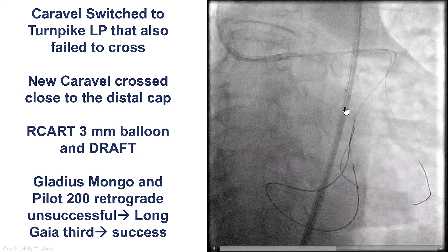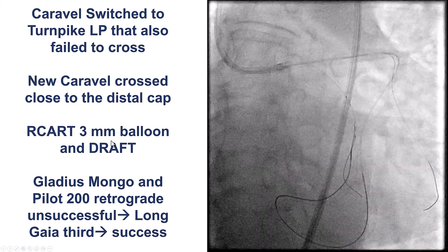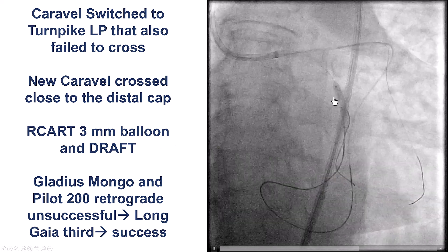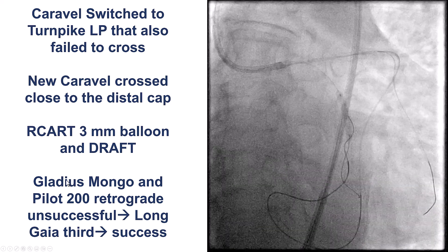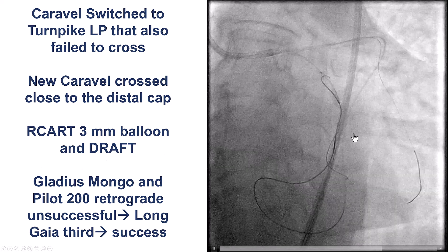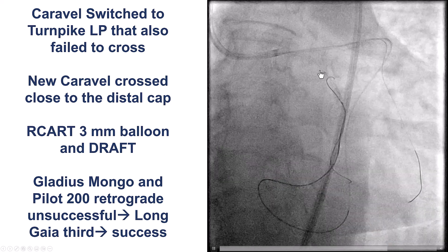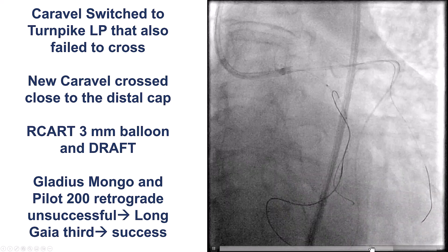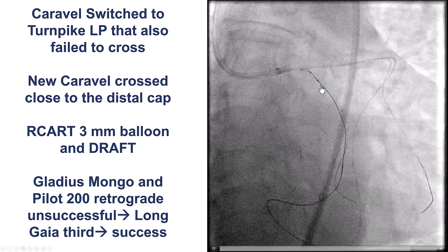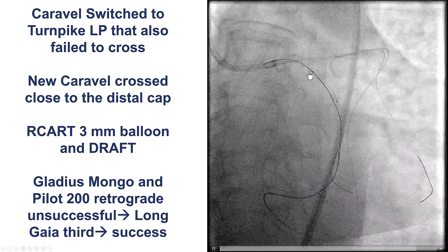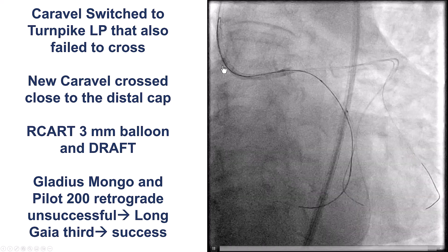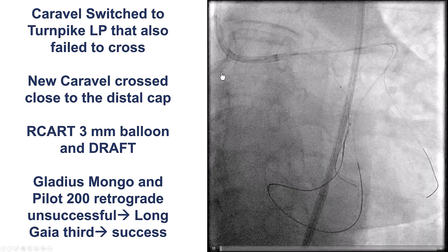We performed a reverse CART with a 3 mm balloon and the DRAFT technique — Deflate, Retract, and Advance into the Fenestration. We deflate the balloon, pull it back, and at the same time advance the retrograde guide wire. By doing that, we can see the retrograde wire jump into the antegrade guide catheter.